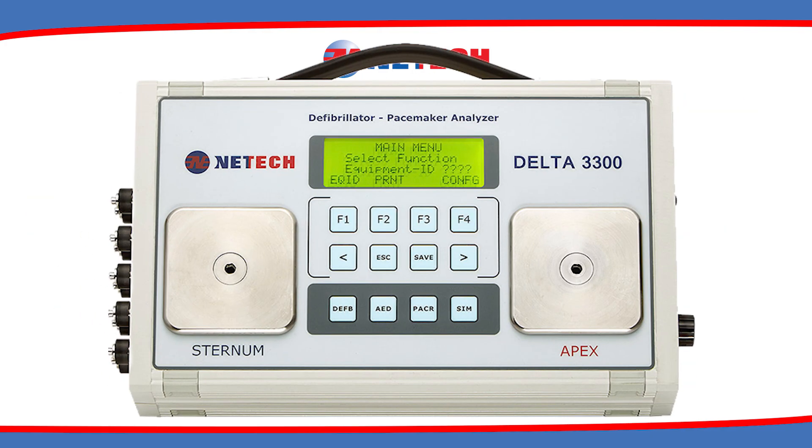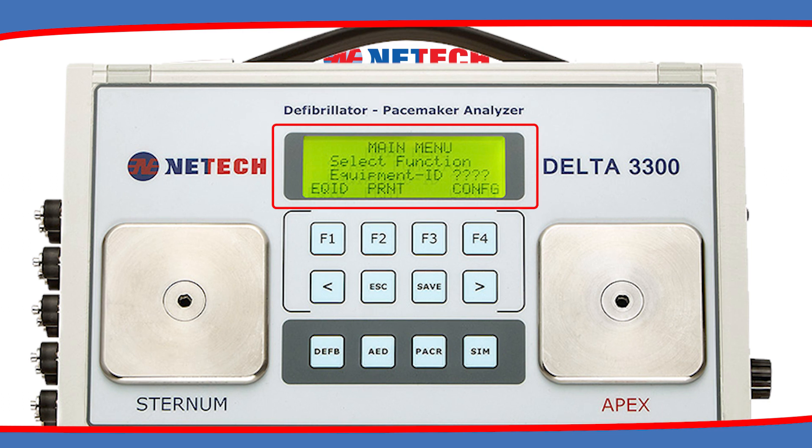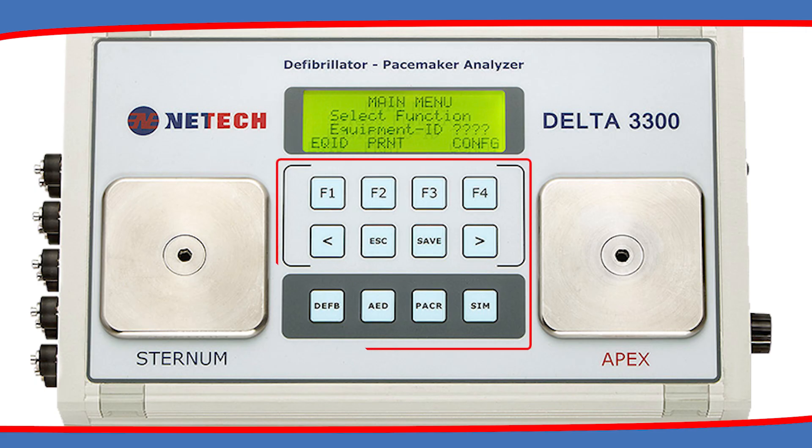The Delta 3300 incorporates a high-contrast 20x4 LCD display with LED backlighting. It features soft-touch tactile keys with dedicated key functions.